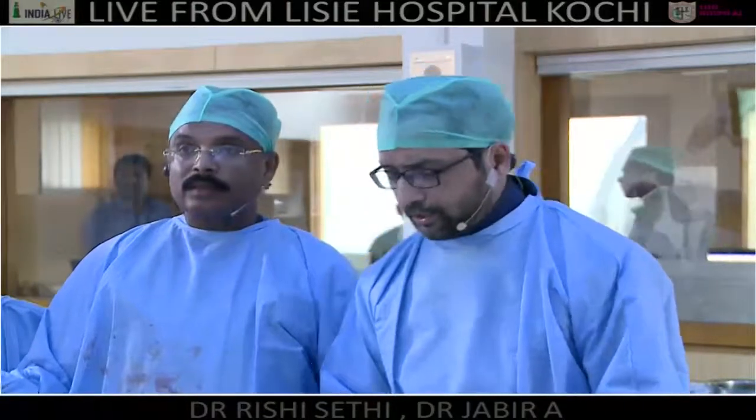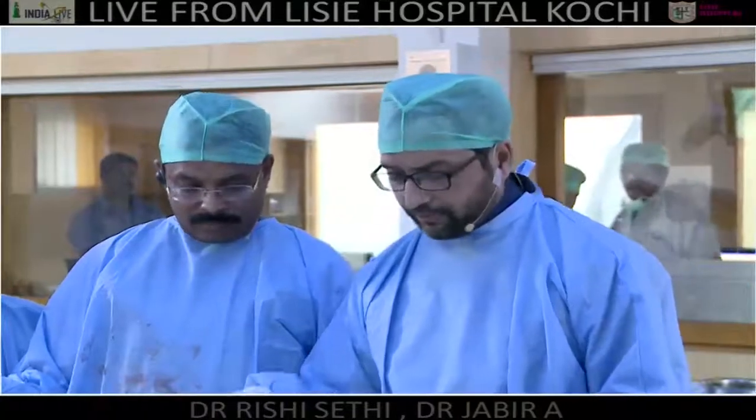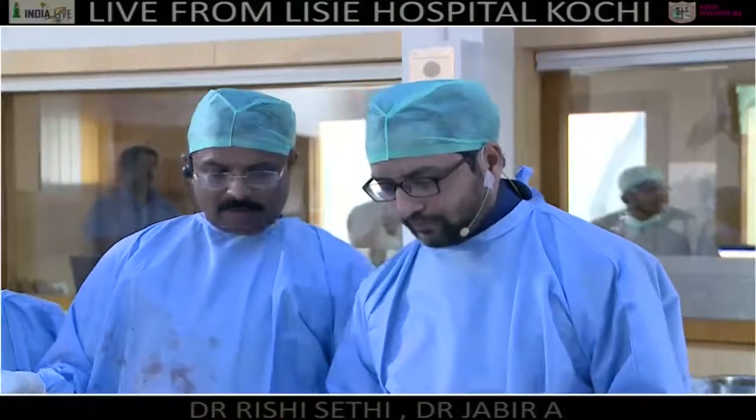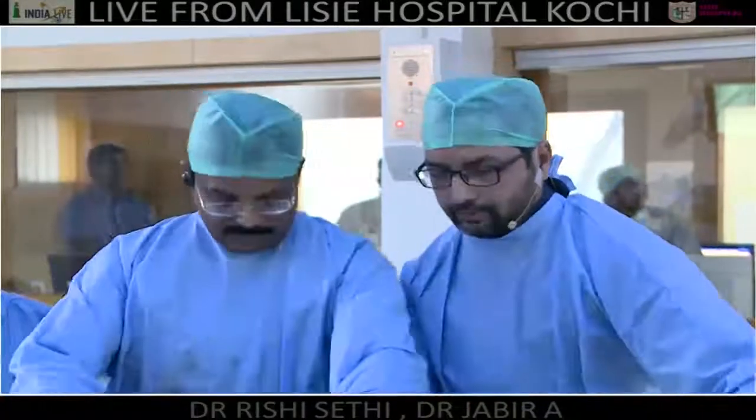Yeah, but sir, clearly, they are low risk lesions, but we have also shown by FFR and IFR the significance in those lesions. Is the patient symptomatic? I just want to know, is it compulsory that in every case one should do an angioplasty? I said learning theater, I think people should go with some good message. Can we have an angiogram again, please? Real physiology study to help us to cut down the PCI at least 30%.